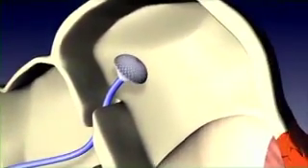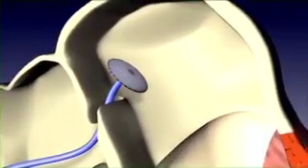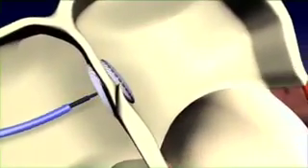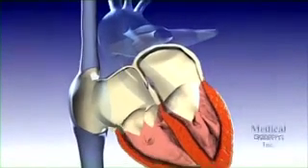So here, showing the catheter, what Dr. Quesada has just done. The catheter is across the interatrial septum, across the PFO. Here's one disc being deployed in the left atrium. And then Dr. Quesada will pull that tense against the left atrium, expand the disc in the right atrium, unscrew the device, and it stays there, and it seals off the PFO.